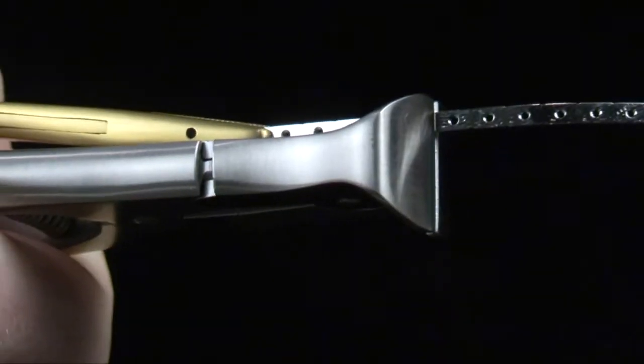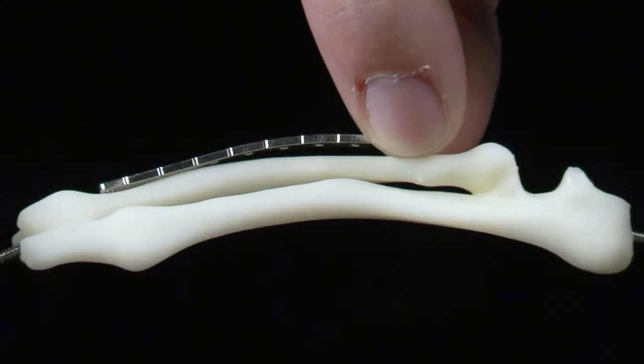Select the desired plate and cut the plate to length using plate cutters. Verify proper plate length.